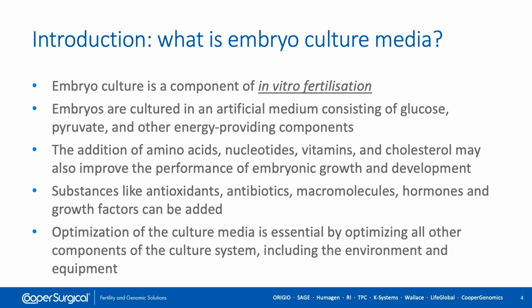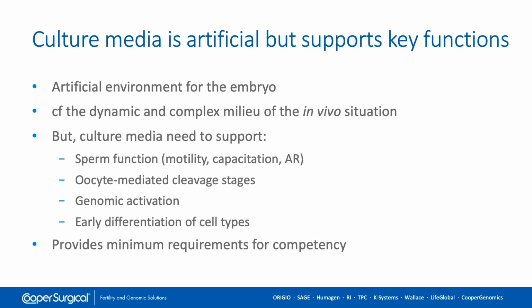We have to bear in mind that every commercially available media has these ingredients in different concentrations and different factors that are added. We have to remember that culture media is an artificial media for embryos to grow in, and it's an artificial environment, and it has to try to mimic what happens in the dynamic and complex environment in the in vivo situation.